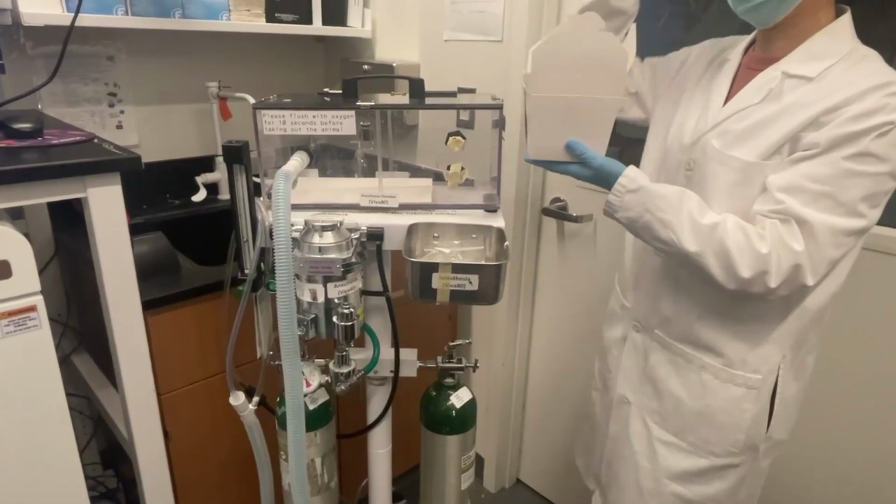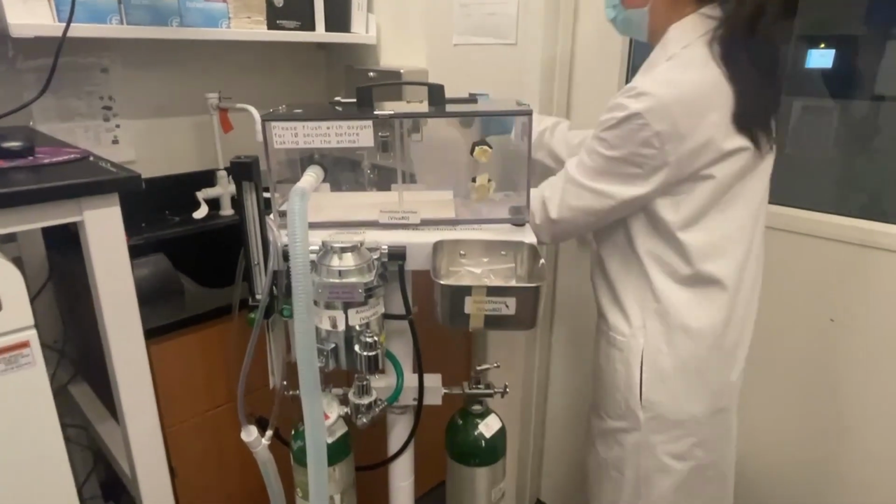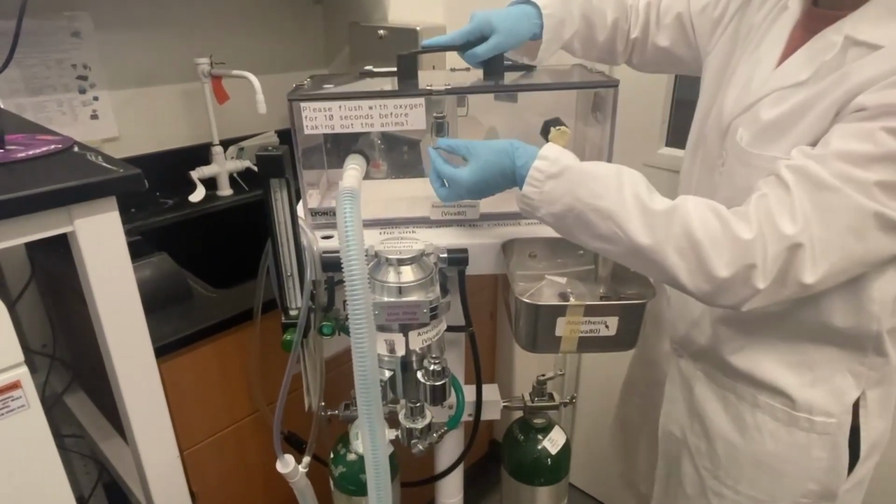In this tutorial, we use isoflurane gas anesthesia for the knockdown procedure. Injection-based anesthesia could be an alternative based on specific aims.